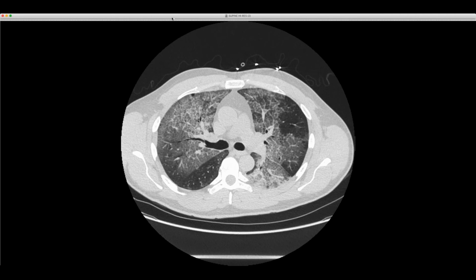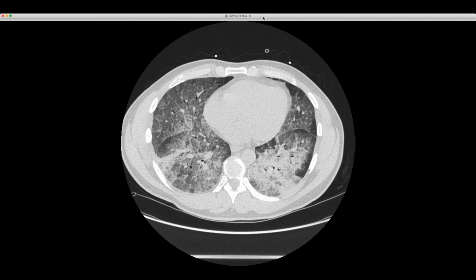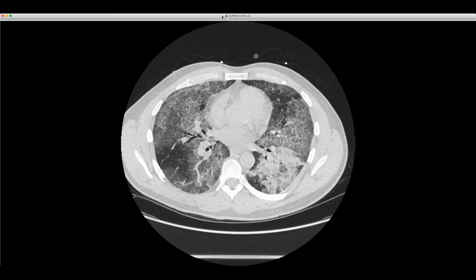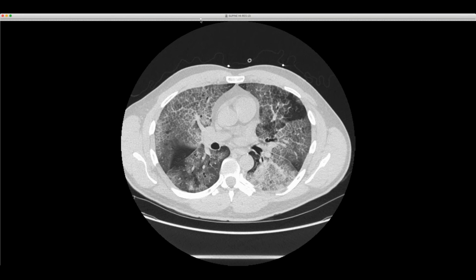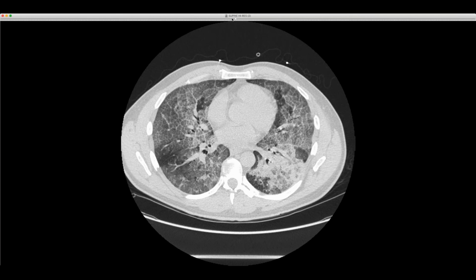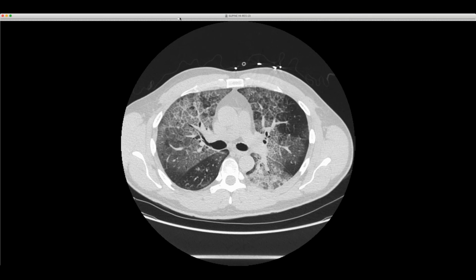Of course, there's a lot of septal thickening, well-defined geographic ground glass accompanying that, a crazy paving distribution, and some areas of consolidation. This was not infection; these more confluent areas were part of the process. They did a biopsy of this. His occupation is a construction worker, and he works with some saw material. What was found on the biopsy is alveolar proteinosis, but also aluminum particles.